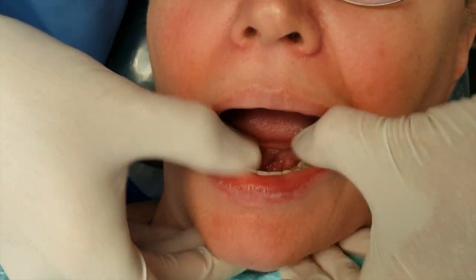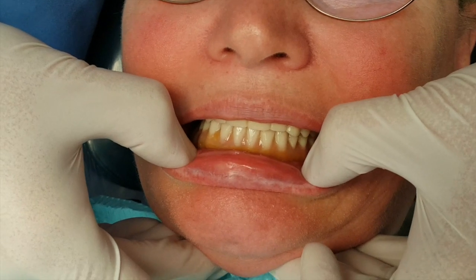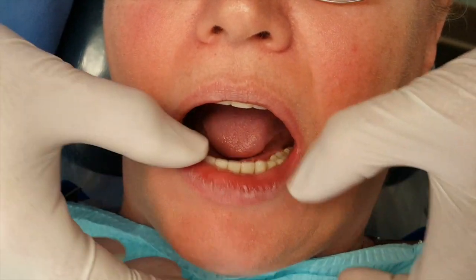Now let me know if it hurts — I'm pressing pretty hard of course. Go ahead and bite down. I want you to wiggle your teeth left and right, and back and forth, and chomp a few times. How does that feel? Great.